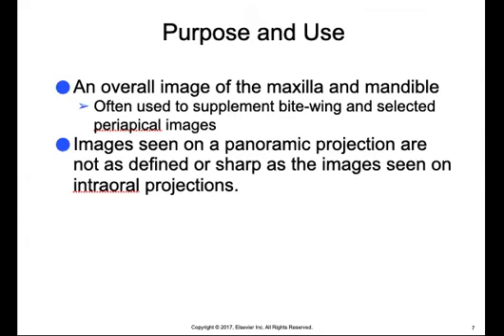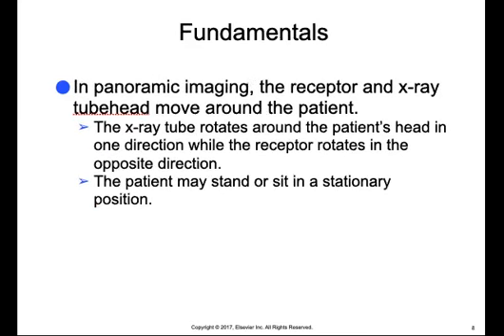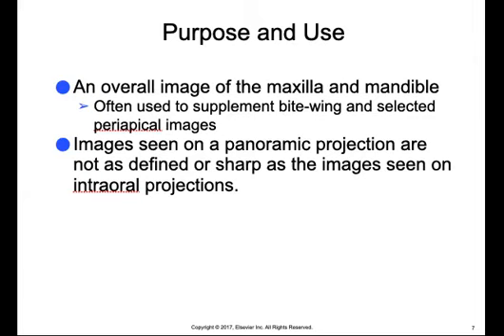Images seen on the panoramic projection are not as defined or sharp as the image seen on intraoral images. So they should not be used to diagnose caries, periodontal disease, or periapical lesions. But they can be used to evaluate the dentition, which is all of the teeth.